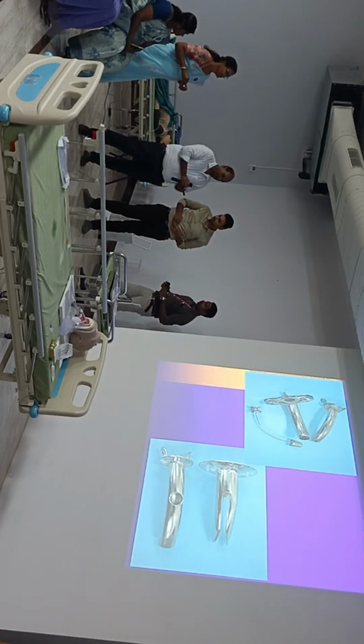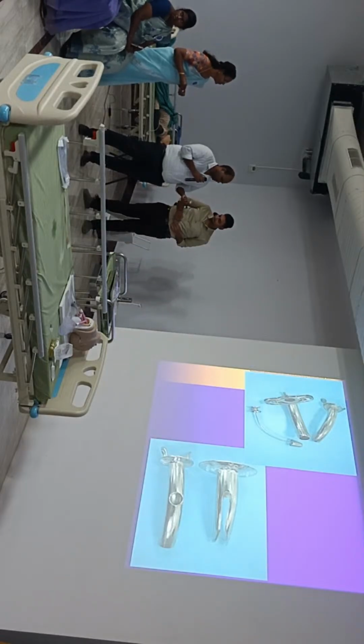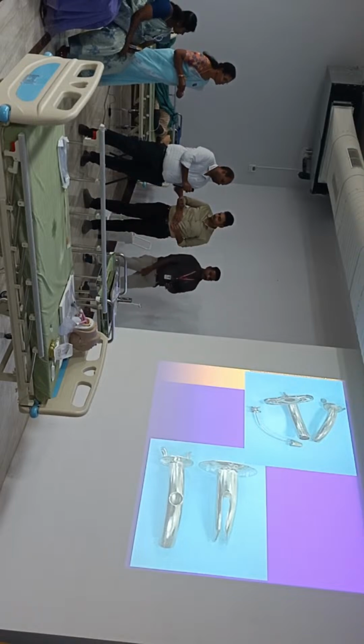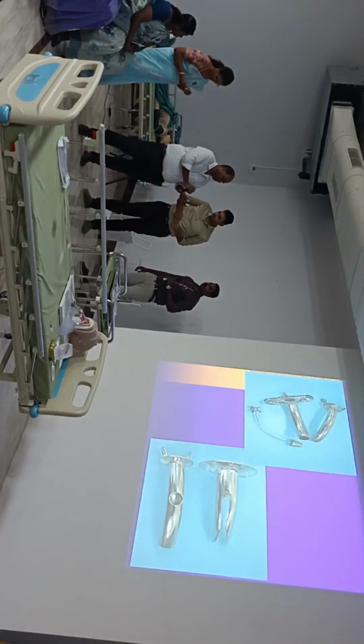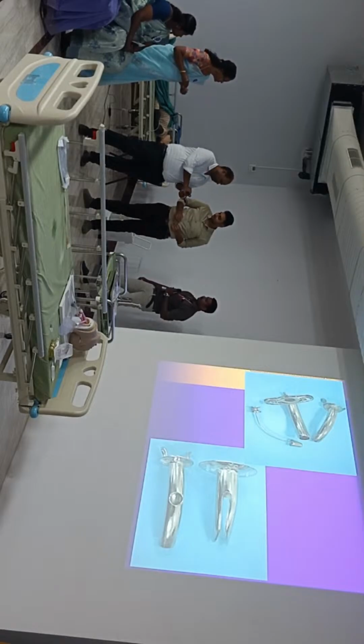So, when we anticipate this, this is one of the oldest tubes. We don't use this tube here now. But this is the alternate tube to the other. So, the lock is there. You need to know, if the tube is blocked and you are trying to remove the tube, you will not be able to remove it unless you open the lock. So, open the lock here.